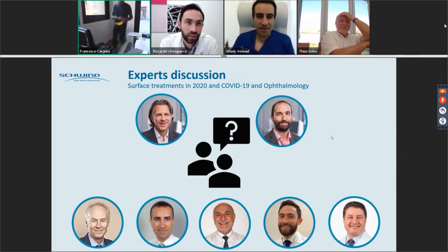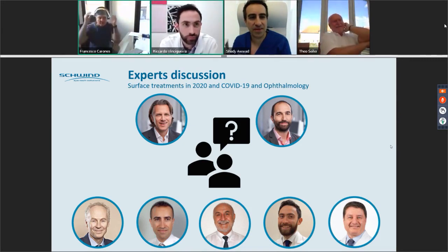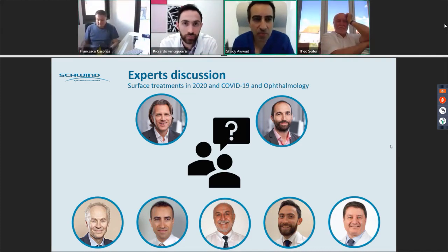With the slit lamp? No, I'll do like this when I visit the patient. When I go to the slit lamp, I do like that. Okay. I can approach the oculars. But Francesco, the problem with that is when you take them out, if the aerosol is in the room, it's going to be the same. It's going to get in your eyes.